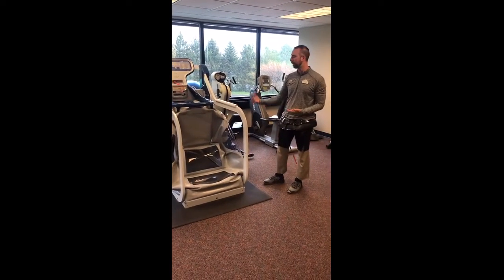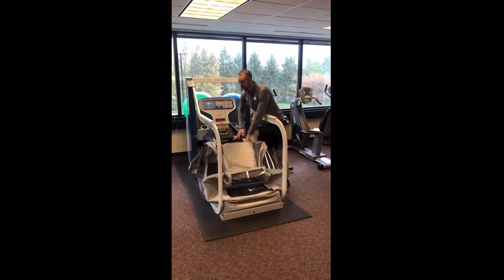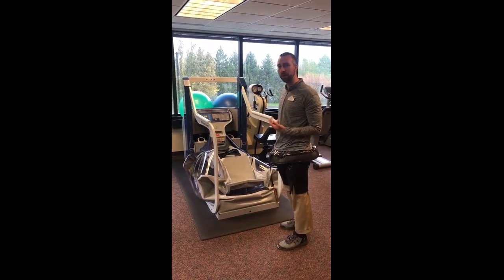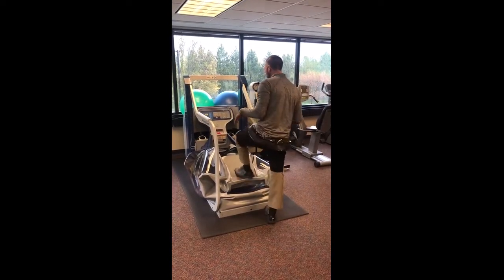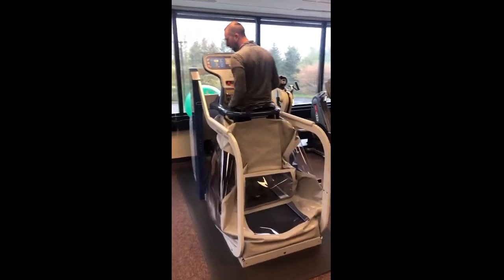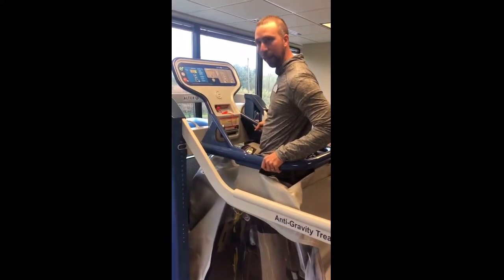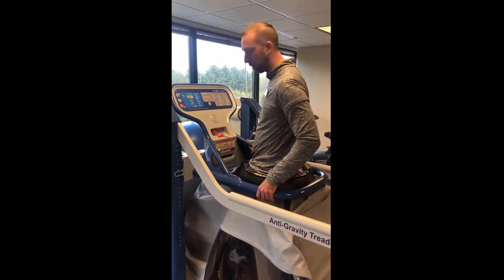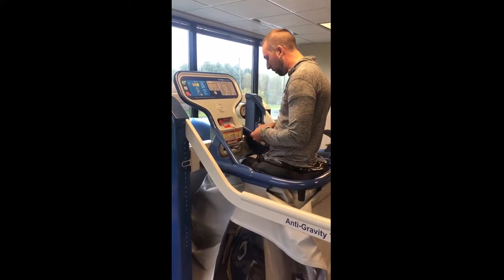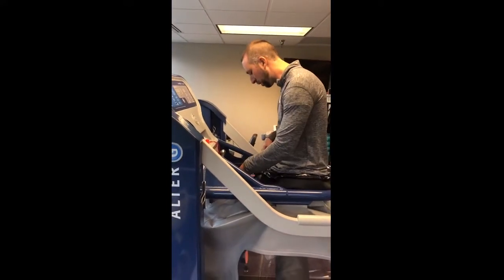Now we have our shorts on and we're going to get into the Alter-G. As you can see, the Alter-G is raised up — we're going to lower it down for our patients. Our clinic assistant or one of our therapists will be here to assist the patient getting in and out. We're going to step up, step into the machine, and stand right on the treadmill belt. This is going to pull up around you. Similar to being in a pool, if you were in deeper water you'd have more support. We'll lock it in place and then zip into the machine. Once you're zipped in, you're not really a fall risk.